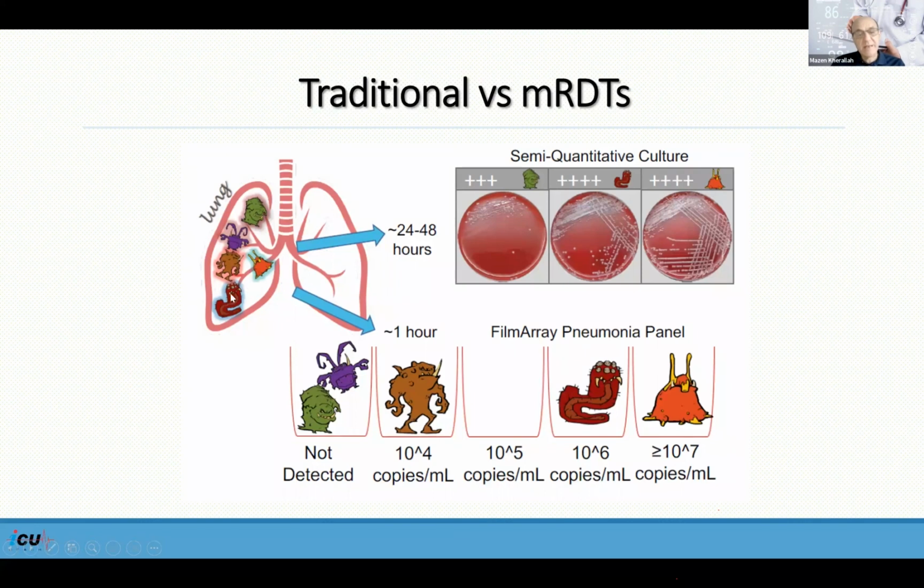First, we select specific organisms. As you see, we're targeting these 5 different organisms here, and we're doing PCR against those organisms. So if we have a different organism, we will not be able to detect it because we're targeting specific ones, but those are the most common ones causing pneumonias.